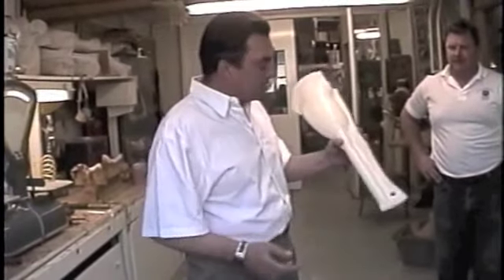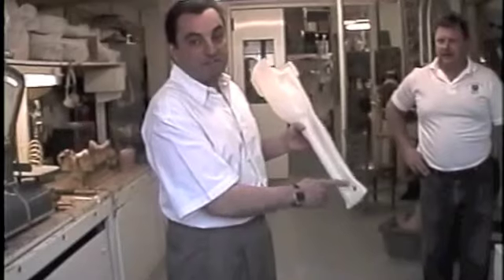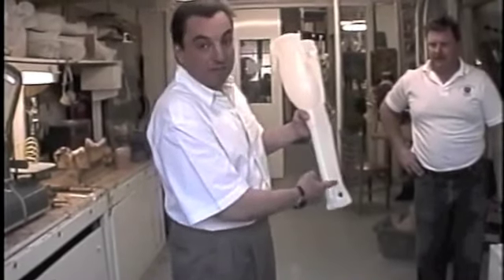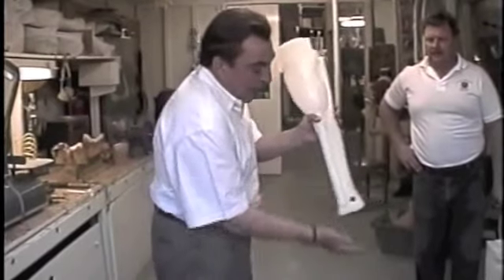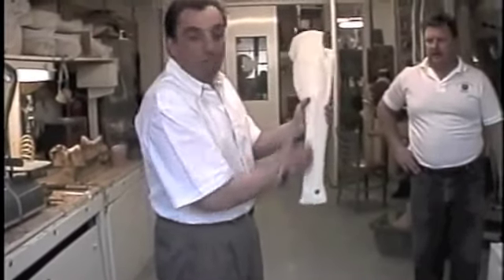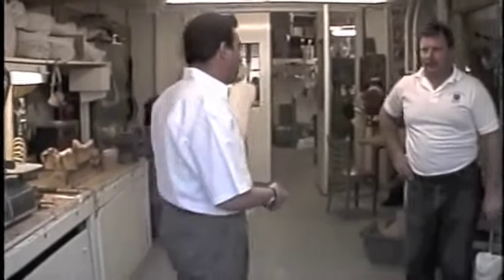One thing that's very important is if you do remove it the same day, you have to remove the seam, because as this plastic cools, this seam is going to be shrinking. So the pylon will actually bow back posteriorly if you leave the seam on overnight without being in the mandrel. So since it was molded today, we're going to cut the seam off right now.